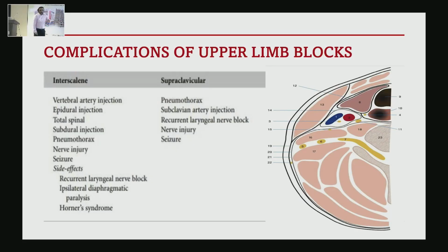Take adequate precautions, understand the anatomy and sonoanatomy, so that you decrease the complications. As we were discussing before, this is our area of interest. When you accidentally go inside, it becomes a neuraxial spread. When my drug tracks in front of the scalene muscle, I involve the phrenic nerve.